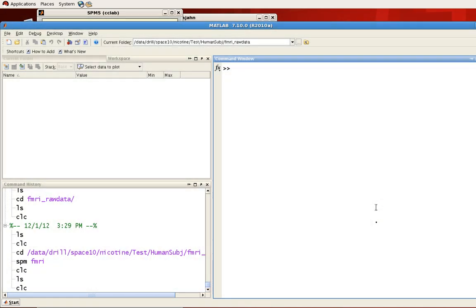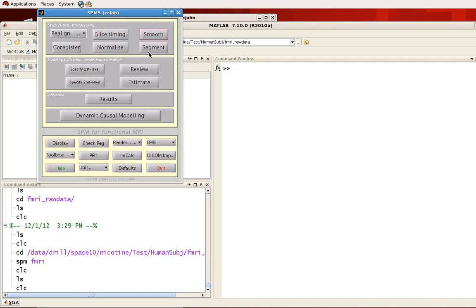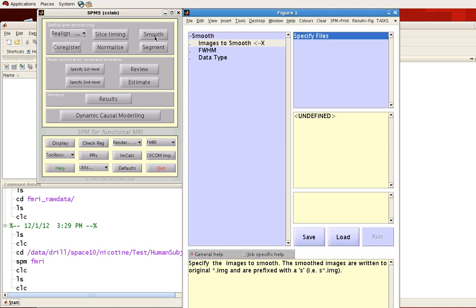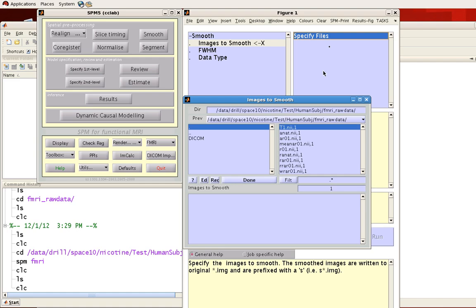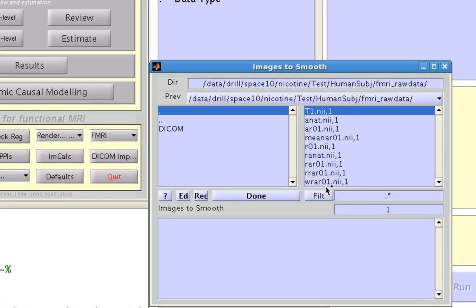To do this in SPM, click on the Smooth tab in the SPM5 graphical user interface. For the images to smooth, click on Specify Files, and we're going to select the warped files which we ran in the previous preprocessing step.